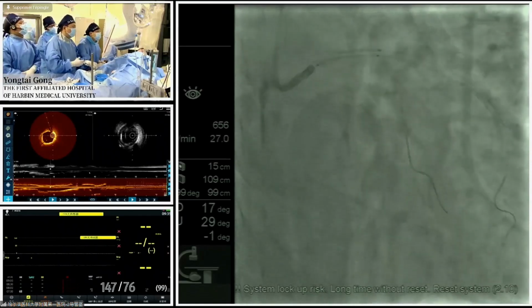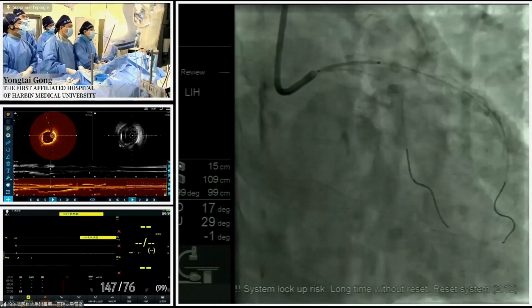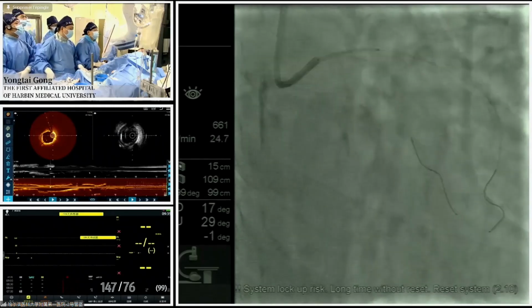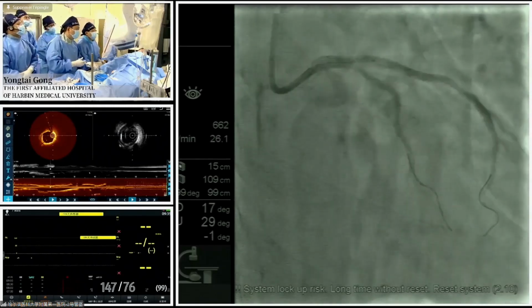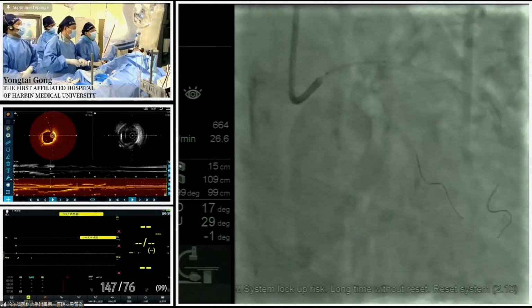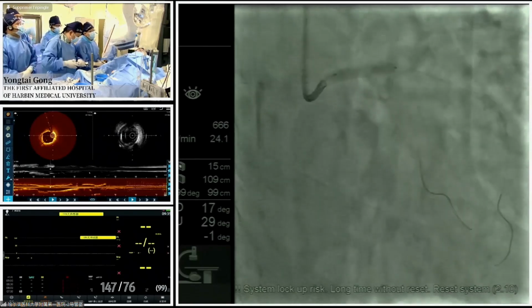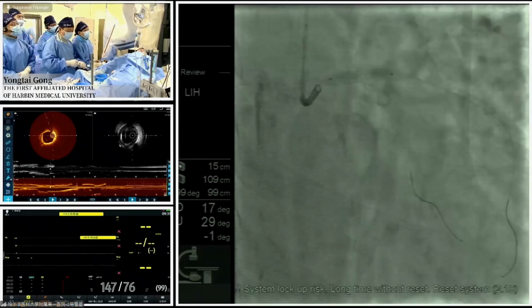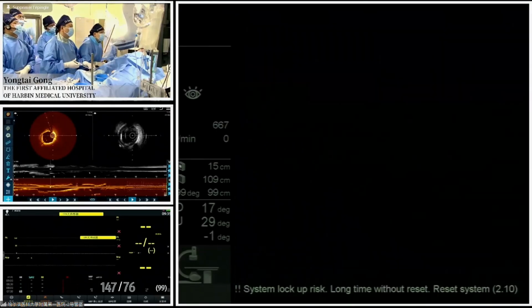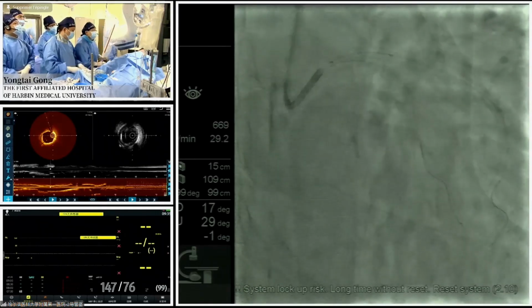How should it be performed routinely after main branch stenting? The POT may correct the malposition of the stent in the proximal main branch, prevent under-strut passing of the subsequent wires, and provide strut opening into the side branch and open the struts in the side branch ostium. So it is easy for the wire and balloon to pass into the side branch.